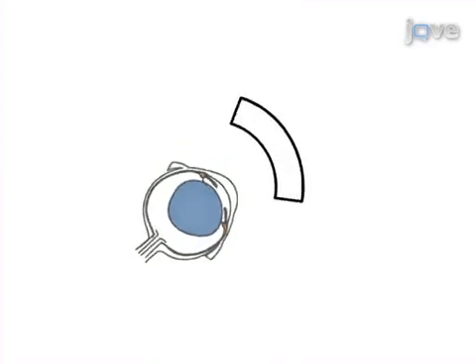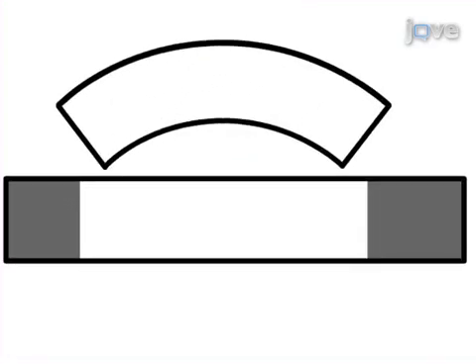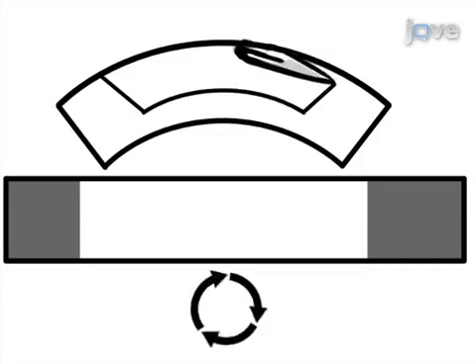Next, the cornea is secured in an artificial anterior chamber. Then, a microkeratome is used to make a smooth pass through and across the cornea.